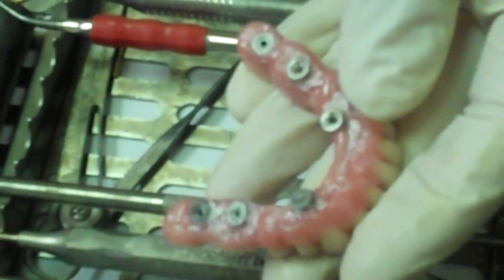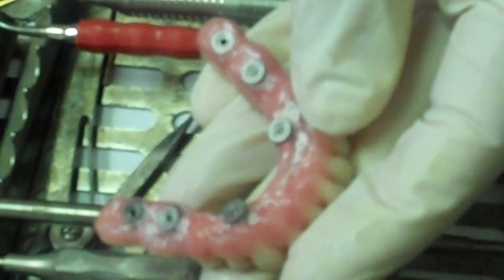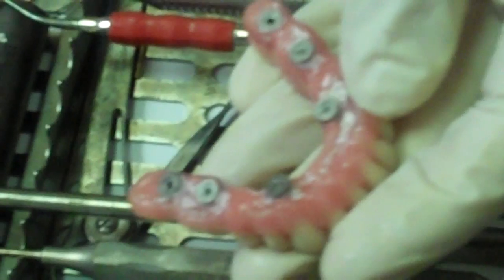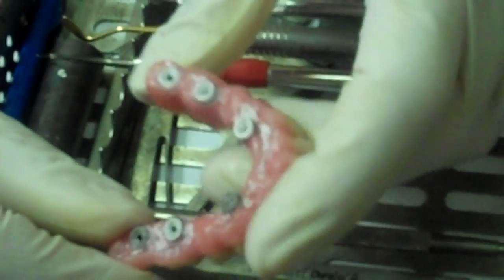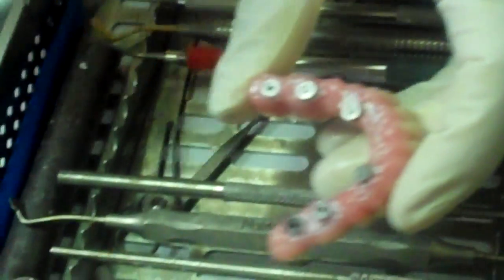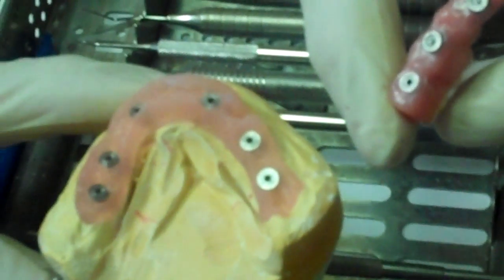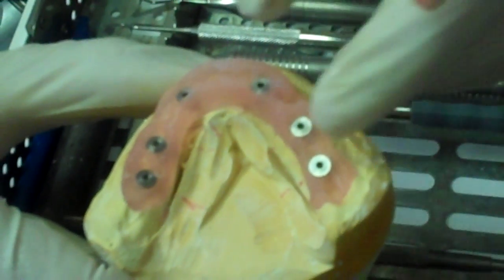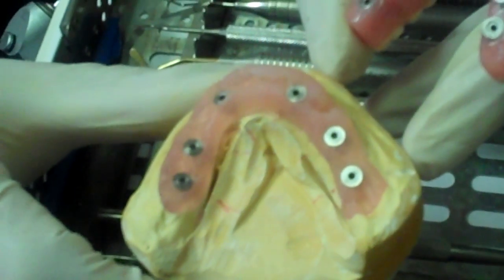there are six metal posts coming out of the bridge. It's an acrylic bridge, made with beautiful denture teeth. The screws go through these metal housings and then are screwed into the implants. And this is the actual model that the implants were made on.